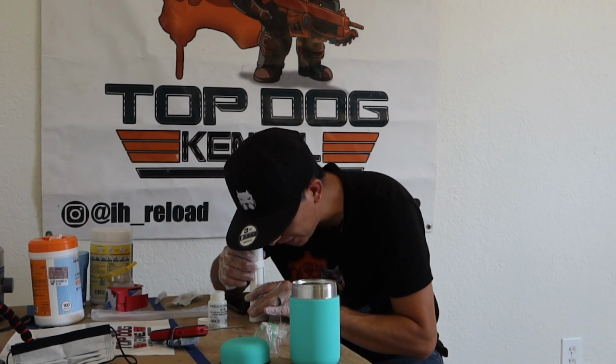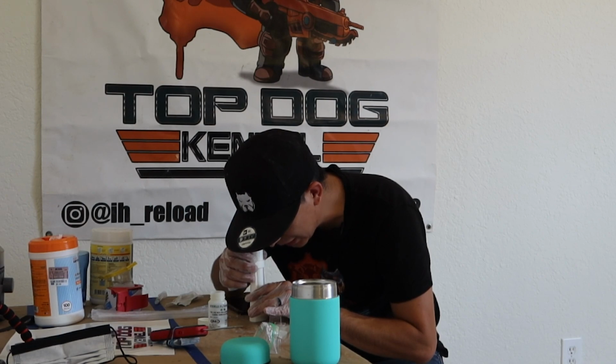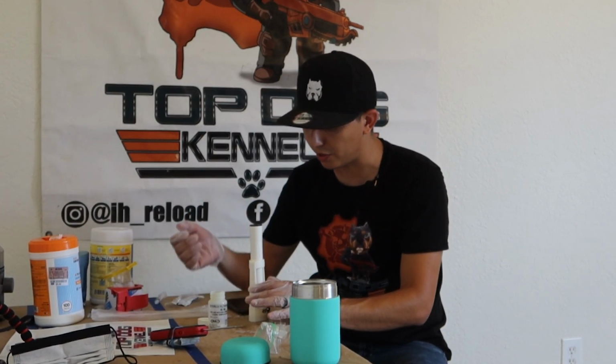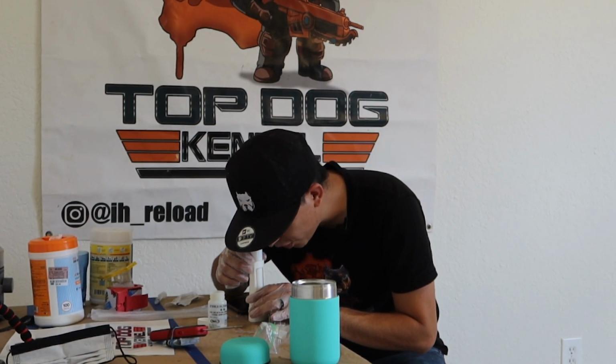Now you are gonna have less sperm because you did dilute it with extender, but if your client is going to have a surgical done, they can spin this out in the lab in a centrifuge and collect all the high density of the sperm cells. Now if they're gonna do an AI, the more fluid you have, the better it is, so you can go ahead and inseminate the whole thing in her with the extender. Now we were able to confirm that the sperm cells are alive and well, so we're clear to go ahead and package this up.